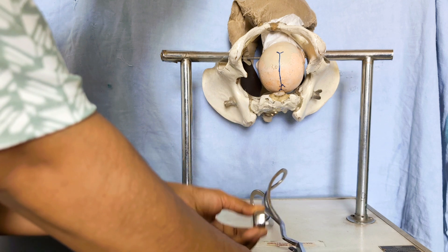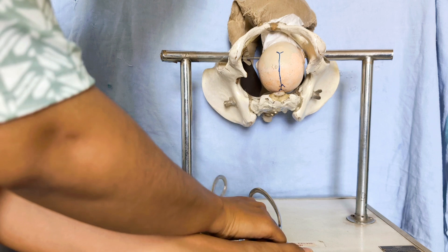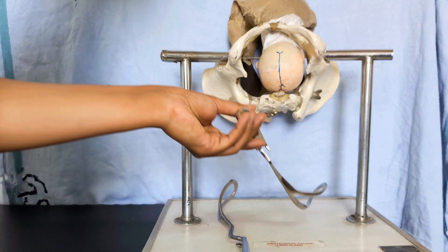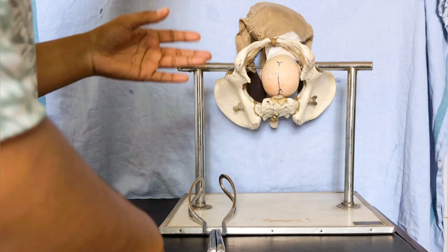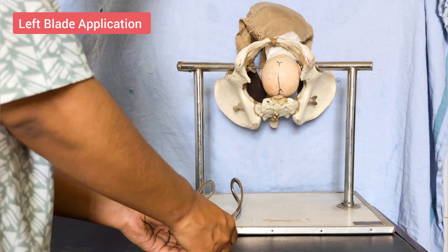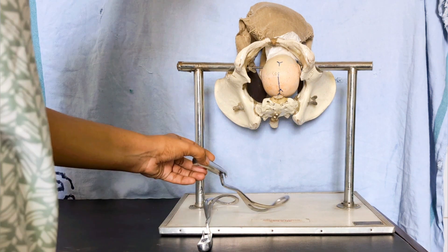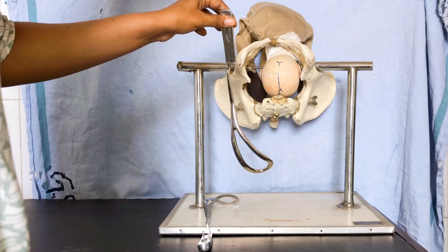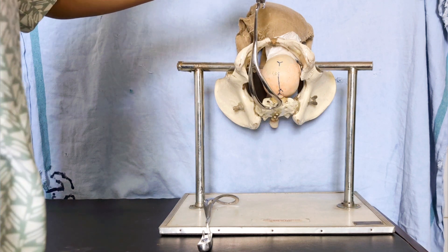Once assembled in front of the perineum, you can easily identify which is right and which is left. The blade held in the right hand is the right blade, and the left hand holds the left blade. The left blade is introduced first. Hold it in your left hand, almost vertically, because you first want to guide it into the posterior vaginal wall.